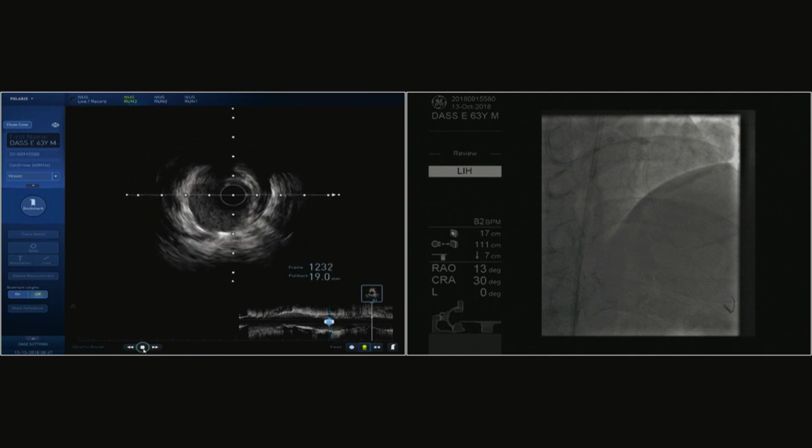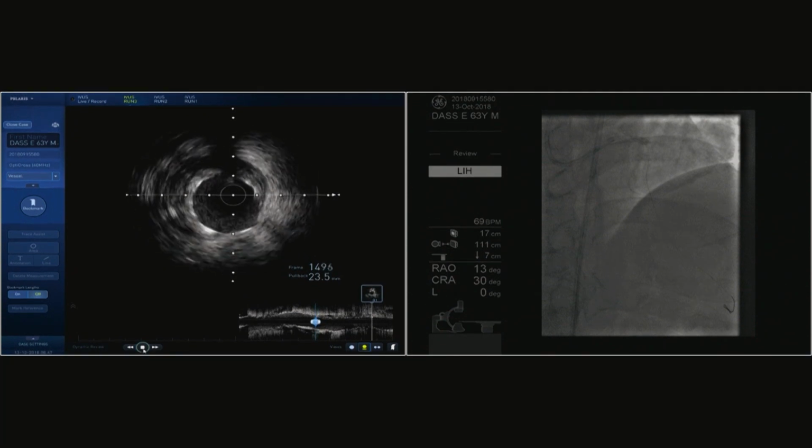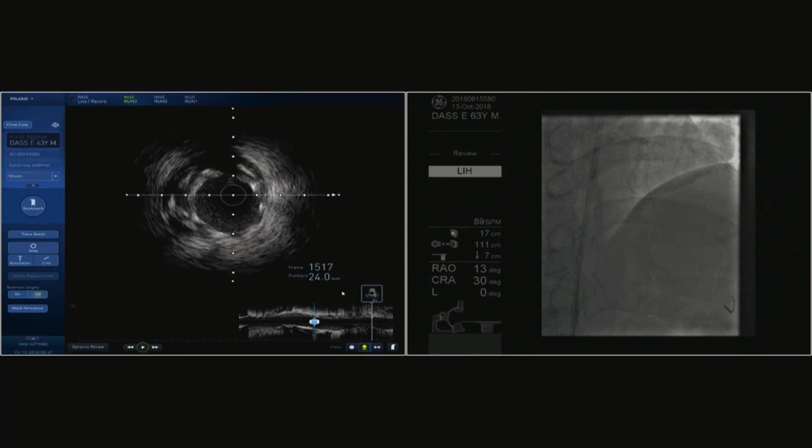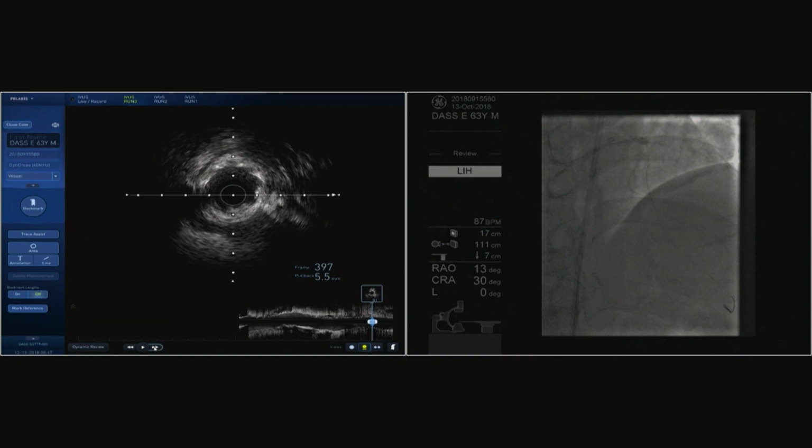Kirti, everybody wants to know what is the distal CSA, if somebody can just tell us. The MSA? Let's do the edge MSA. Distal edge MSA. Can I have the trio balloon, please? Again. Just give me the same stretch balloon. Around there. Check the stent size. No, it was 2.5. It was 2.5. Yeah, 2.5.